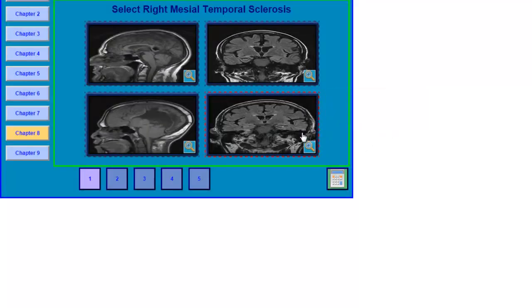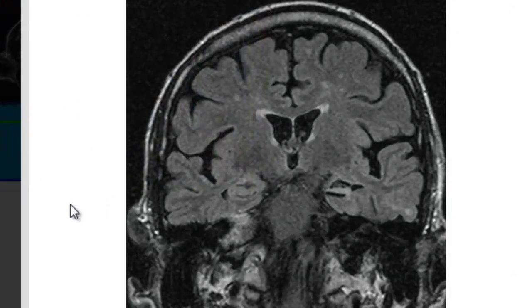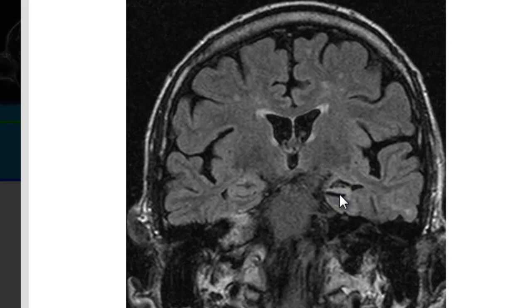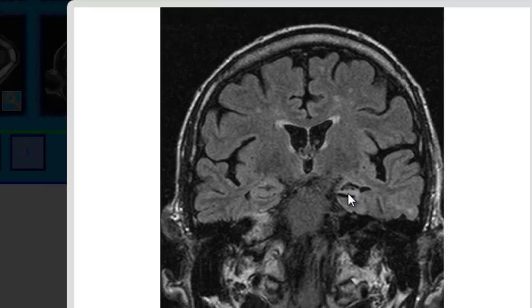What about this patient? This is a coronal FLAIR image of the temporal lobe. This is the left temporal lobe and this is the right temporal lobe. The most striking finding on this MRI is the area indicated by the arrow. Compared to the hippocampus on the right side, you can see that the left hippocampus has lost its architecture — it is smaller in size and bright in signal. This is left mesial temporal lobe sclerosis, not right.